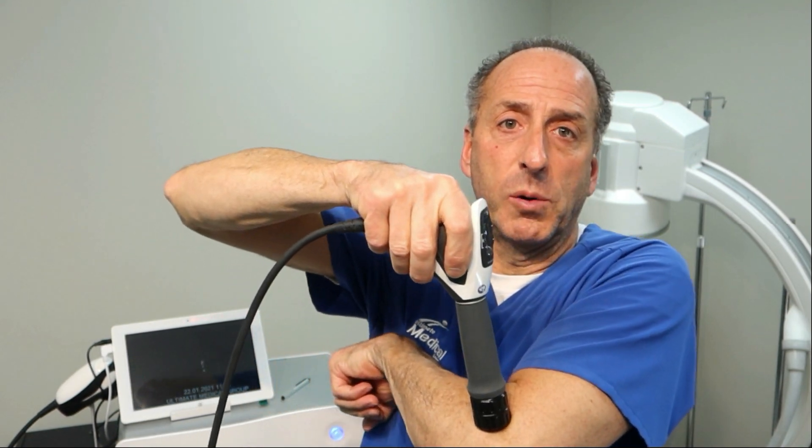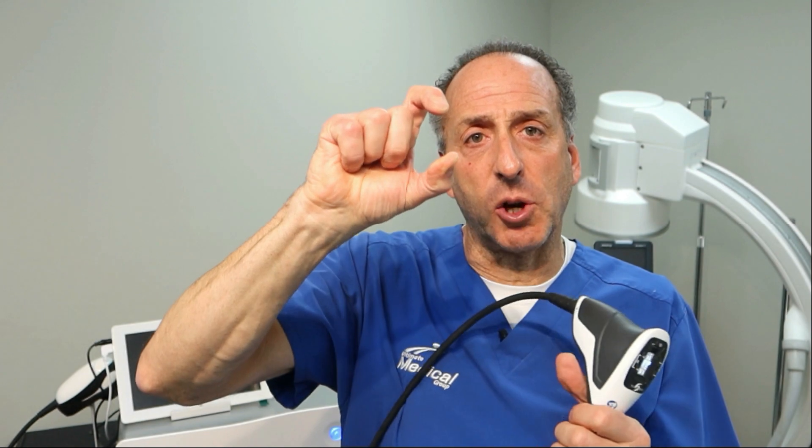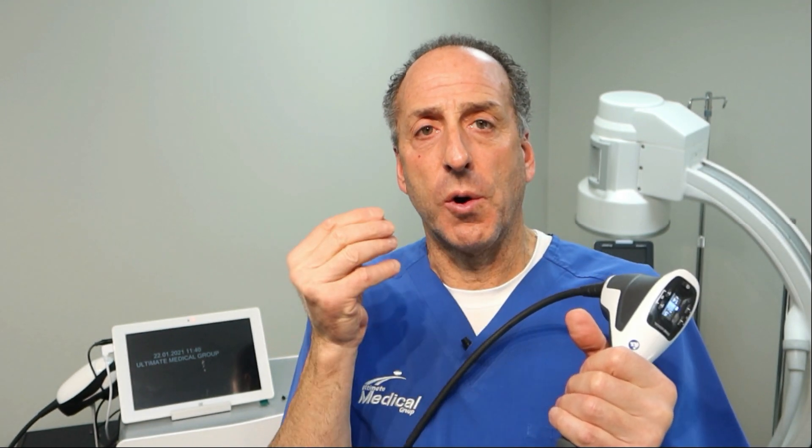As I'm working — let's say I'm working on an elbow — we can work on any body part: spine, neck, shoulders, elbow, wrist, fingers, cervical spine, thoracic spine, lumbar spine, hips, knees, every joint, ankles, everything. We can work on everything. And so what actually happens is that every time that little projectile hits the transmitter, it creates a pulse. The computer records the frequency, the intensity, and how many pulses — how many times that energy is striking the tissue.